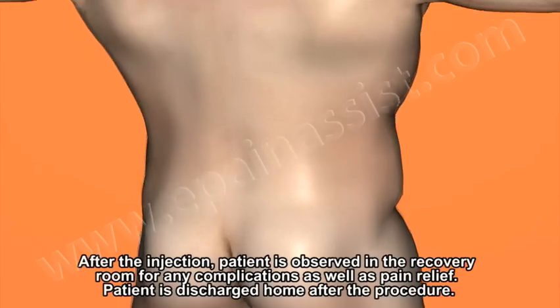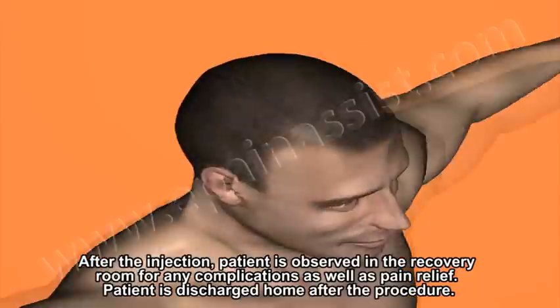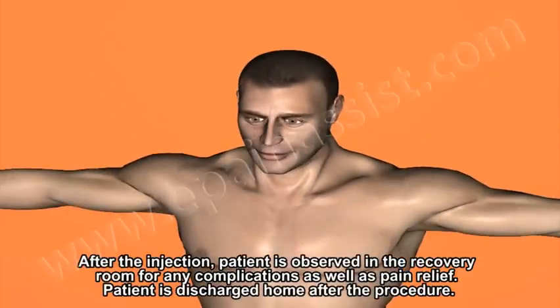After the injection, the patient is observed in the recovery room for any complications as well as pain relief. Patient is discharged home after the procedure.